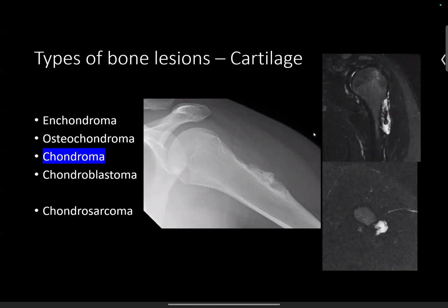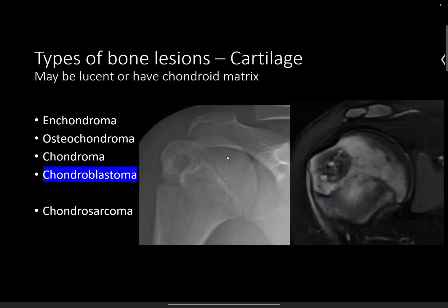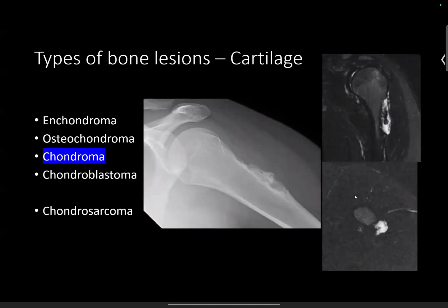All right. Do metastatic bone lesions have periosteal reaction? It may or may not. Some of these lesions, it depends, I think, how close it is to the cortex to irritate the cortex. So you may or may not have that. So don't let that dissuade you. If you see something that looks concerning, then don't wait to see periosteal reaction.